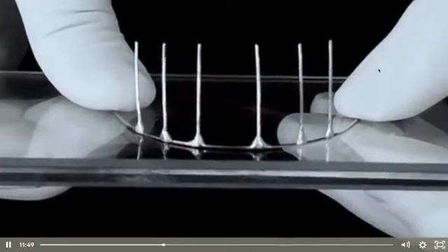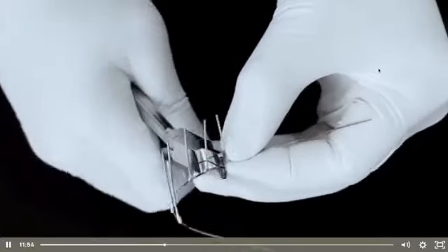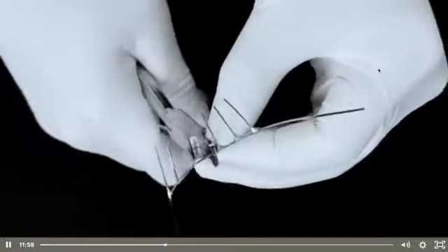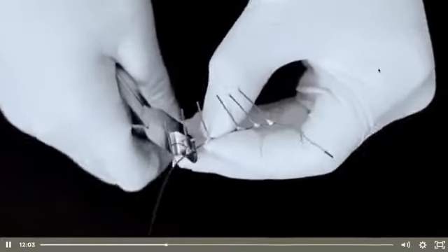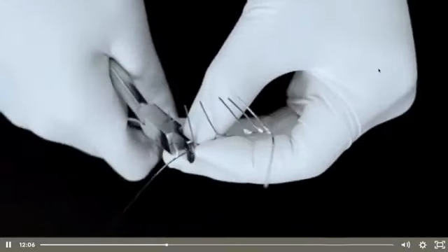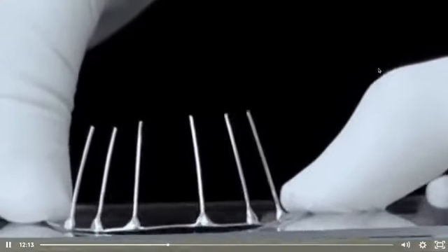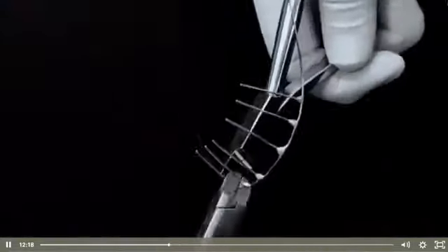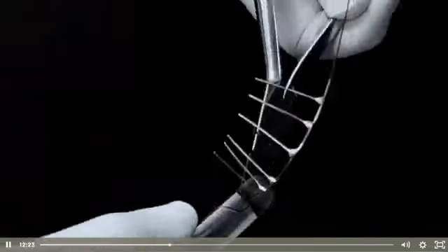I'm going to show this to you with this experiment that I gave to my students. This is the way I apply the torsion. When I do this very delicate rotation of my wrist, going closer each time with my two fingers that are supporting the movement, close to the pliers, I'm doing just little twisting of the wire in the anterior segment. When I do that, I'm really applying a torsion to the anterior segment. So look at this. I'm going to stop it here so you can see.